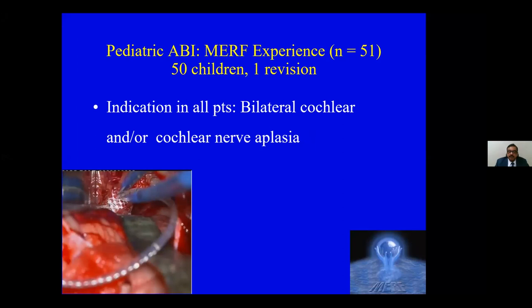Now, what's important is that we look at the way he's saying it. Oh, papa. Now, that's known as the prosody of speech, the rhythm of speech. Prosody tells you a very important piece of information, and that is the child is listening to his own speech, which means that his hearing is present. He is monitoring his own speech.